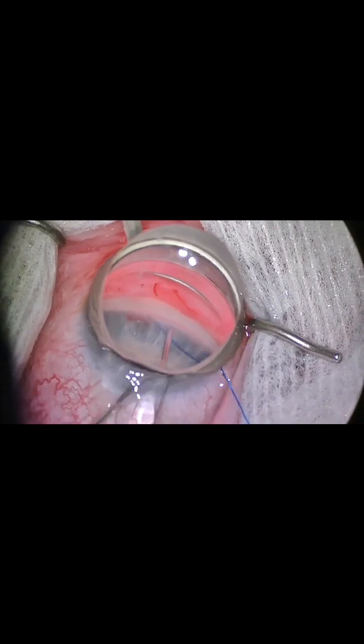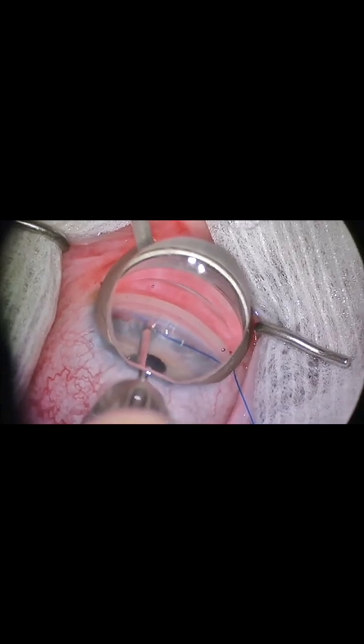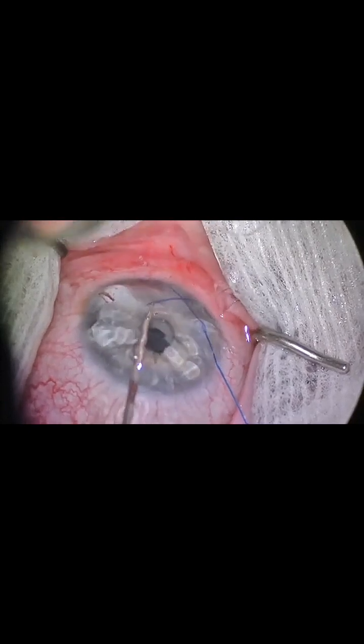To perform the trabeculotomy, we need to hold one end of the suture inside the anterior chamber and then pull the other end out of the eye.